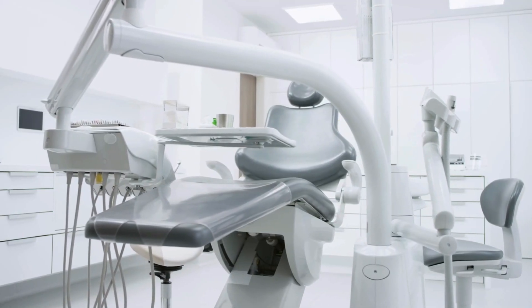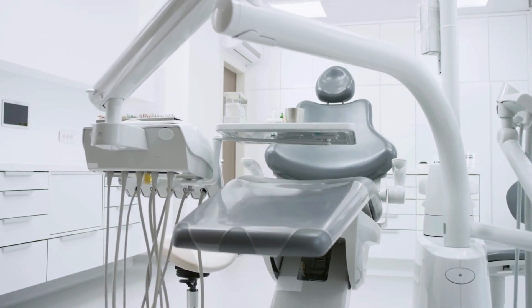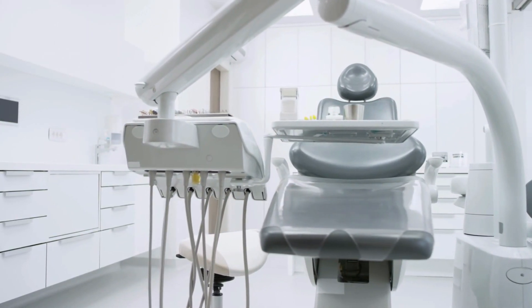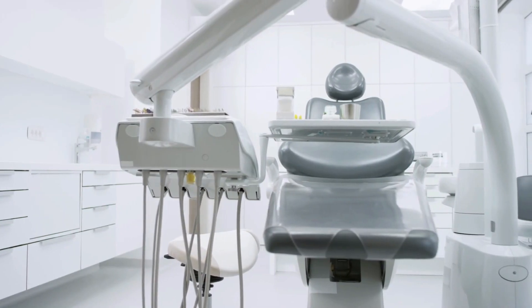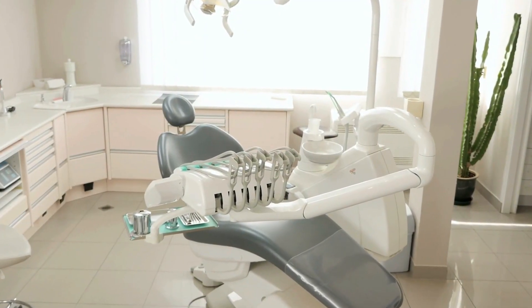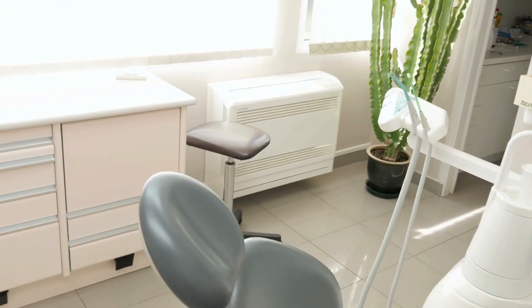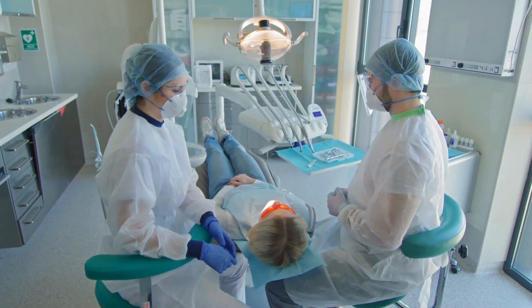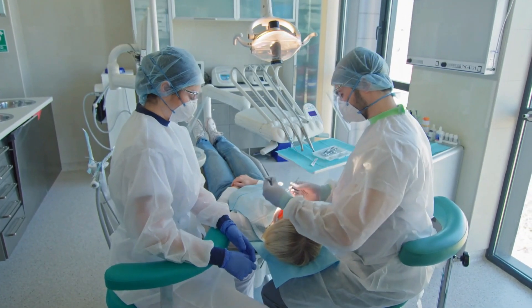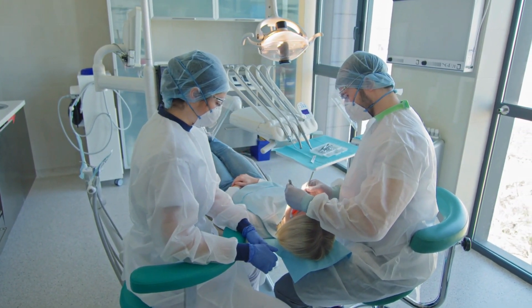To ensure oral and dental health, dentists use many different devices, hand tools, and consumables. Dentists need a patient chair to treat patients in their clinics — this chair is called a dental unit. All treatments take place on this chair; the dentist positions the patient to get the best view and performs treatment with the devices and tools on the unit. Now let's learn what these devices, tools, and materials used in the dentist's clinic are and where they are used.